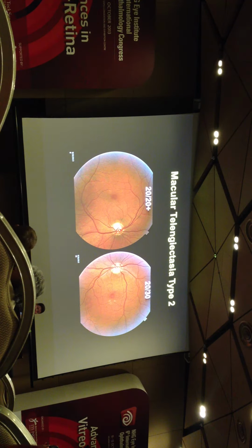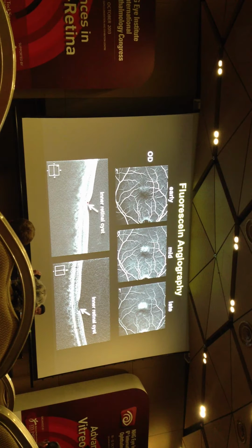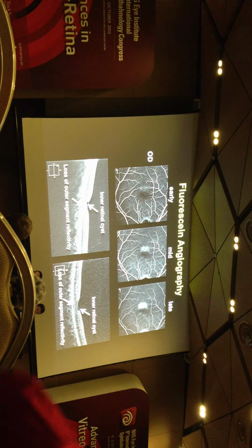People have been doing this manually, what I'm about to show you, but now we have an automated algorithm that can do it. This is a patient with some earlier onset leakage temporally, with this characteristic OCT finding, draping of the ILM here, these slit-like cystic changes. But there's also some darkening here, some abnormality in this area that would appear normally dark in the ISOS slab. But that's because that's where a lot of pathology starts.